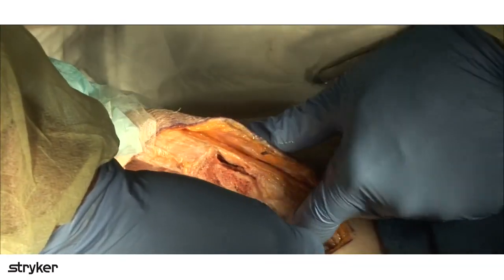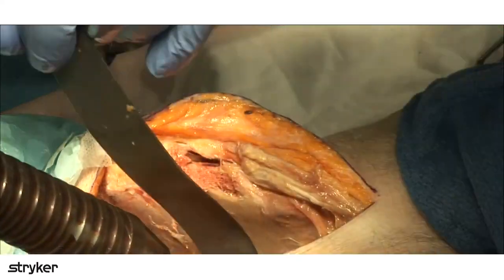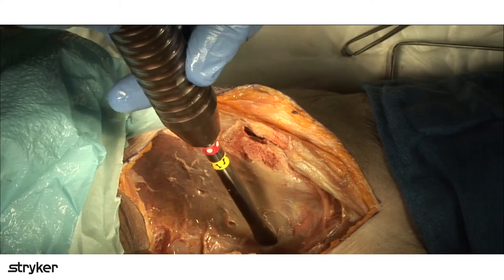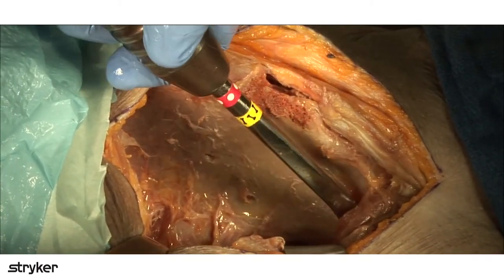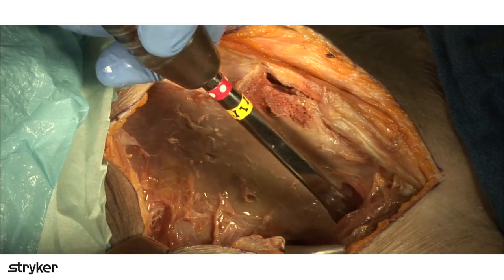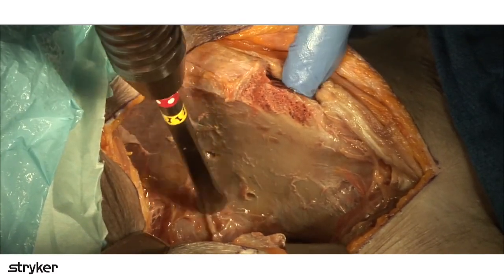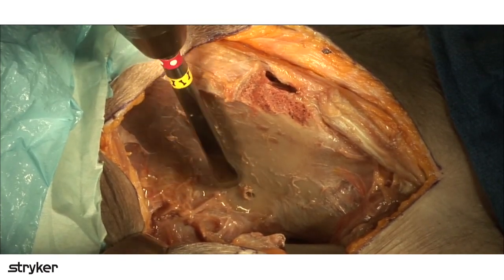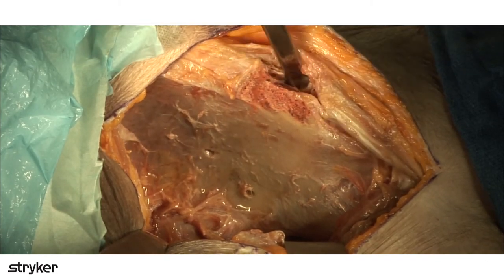But just by having that ASIS osteotomy, your exposure out here distally is tremendously expanded. You're way down on the anterior wall now. You're over the brim from above, and as much as you can see with an AIP and a standard lateral window, this osteotomy opens it up tremendously.